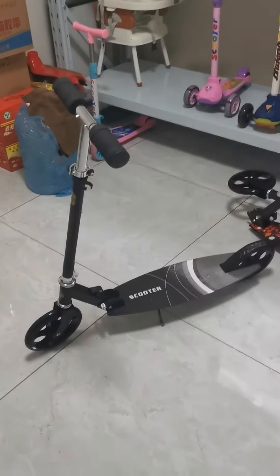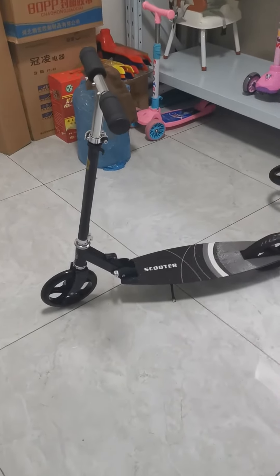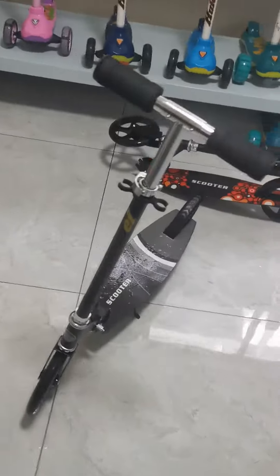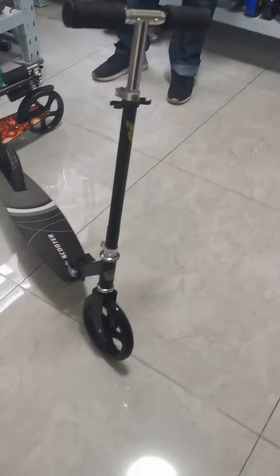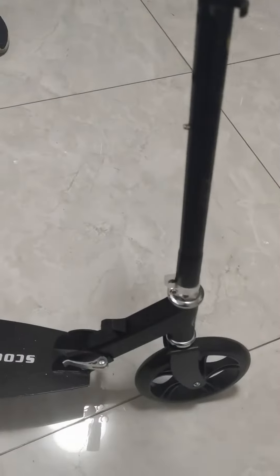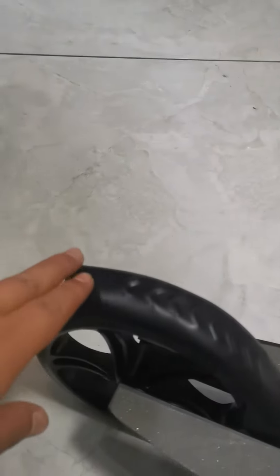It's my honor to introduce you guys to this scooter. First, let's check the specifications. It has three adjustable heights for the handlebars — the bottom one, the second one, and the highest one — so three height settings.